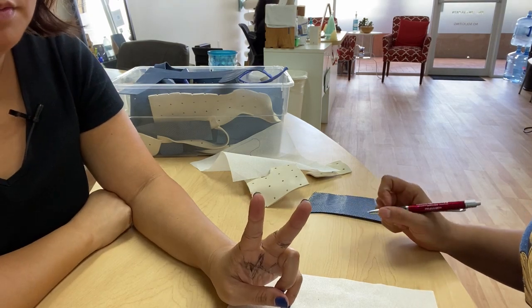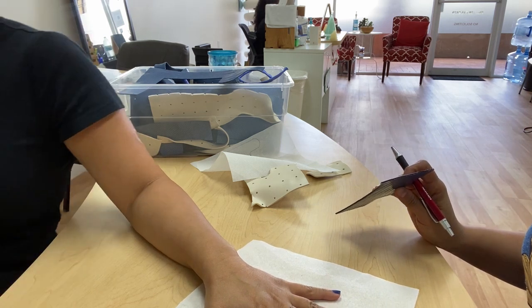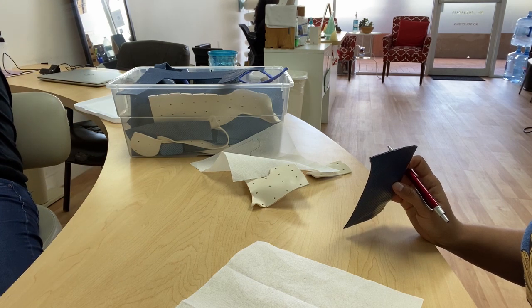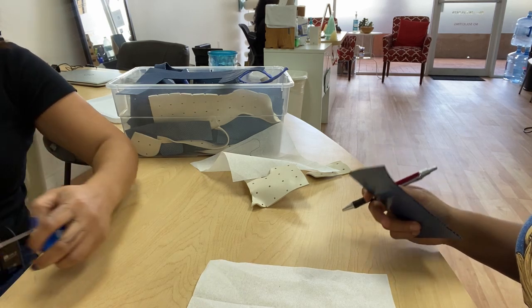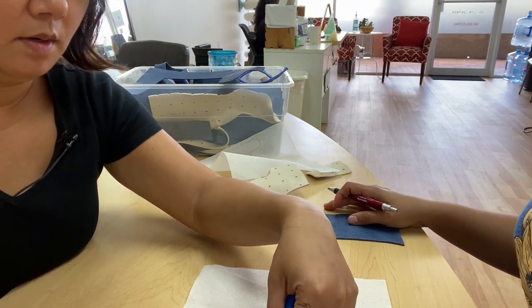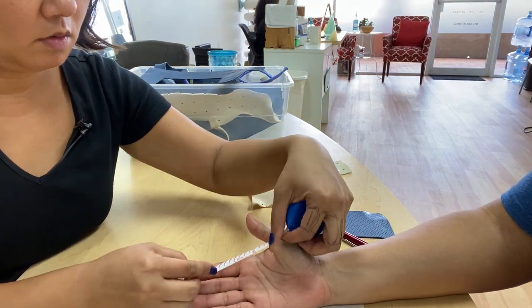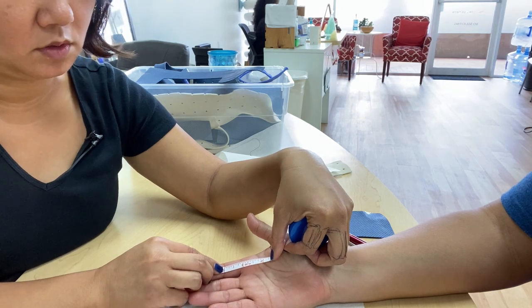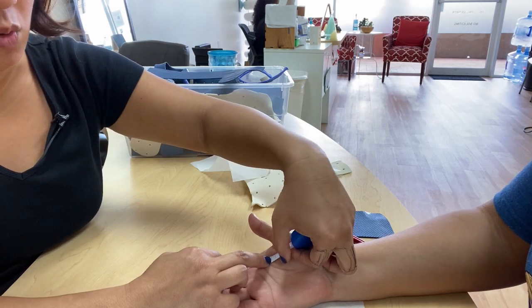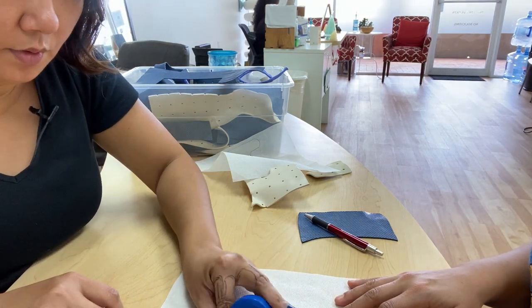I'm going to show you two ways of measuring. You can measure with a tape measure. So let me borrow your hand real quick. From the PIP, we're going to do it for the index finger. We'll make it right from the PIP, just so it's a little bit long. We're going to make it two inches and a quarter. Two inches and a quarter.